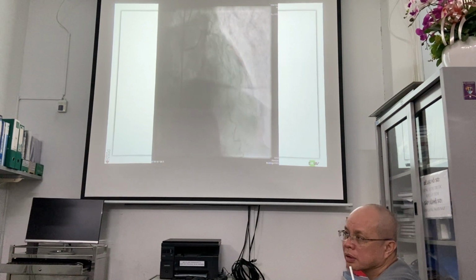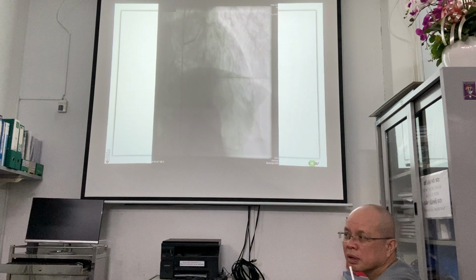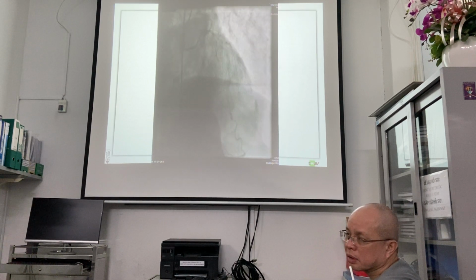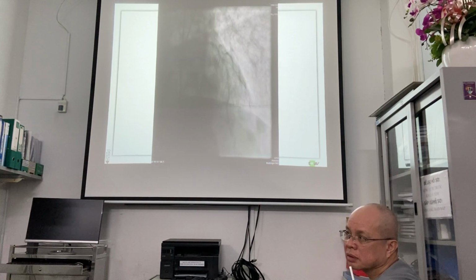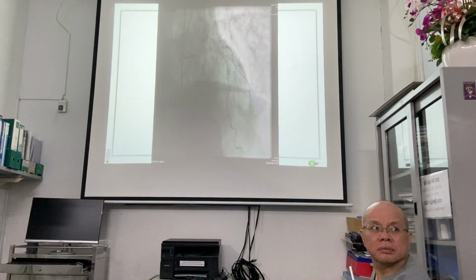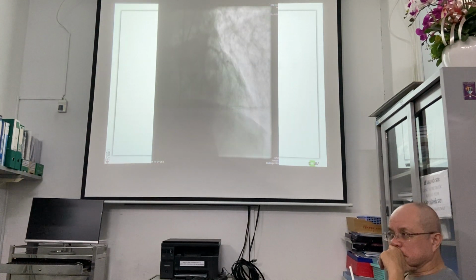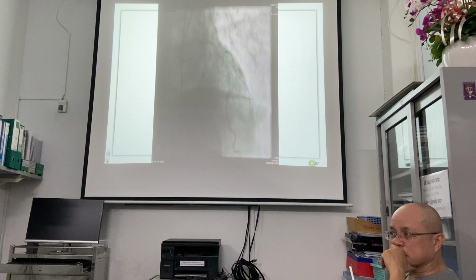Any intervention you do, also for structural, for example, when I sometimes make a loop to close the VSD after acute MI, if you pull the heart on the wires, you will stretch the vessel in the heart. It will provoke an extreme vasovagal reaction. Separate the vessel from the heart.